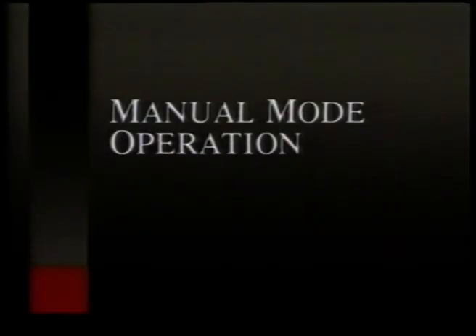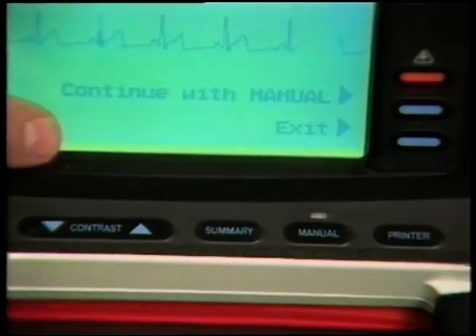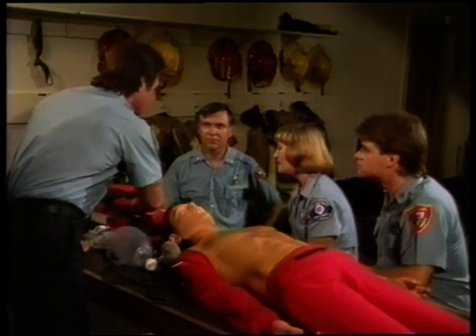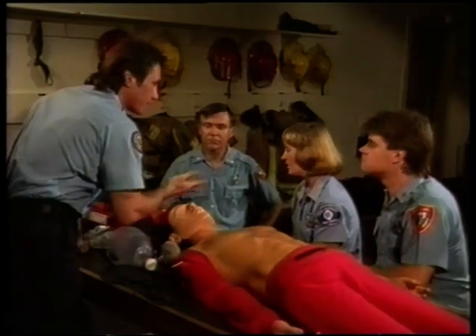When the advanced life support team arrives, manual operation can be accomplished by pushing the Manual button. Manual mode operation means that it is not necessary to perform an analysis prior to delivering a shock. The LIFEPAK 300 will not analyze the patient's rhythm while in manual mode. The operator has full control over the energy selection, charging, and delivery of shocks. Manual operation is only for authorized personnel trained in rhythm recognition.